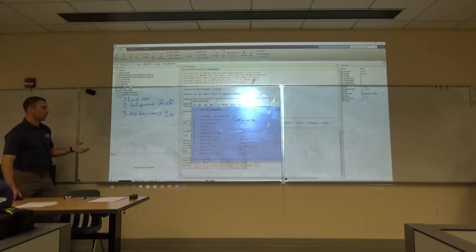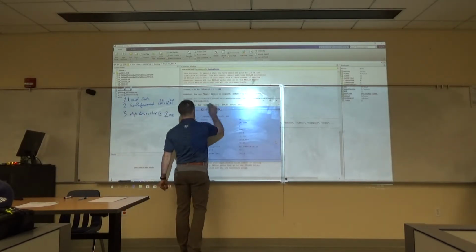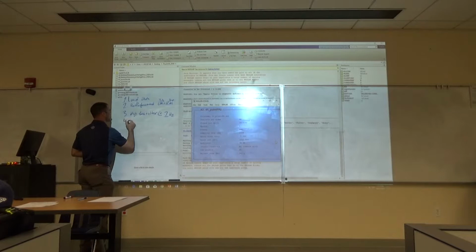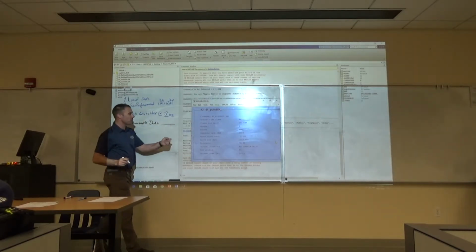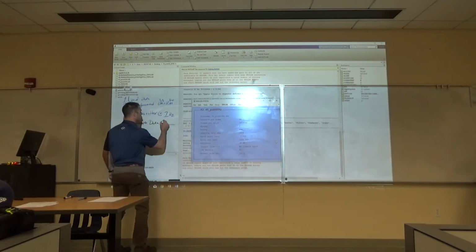So we got to do another step now. Yeah, and we did this last class too, if you remember. Actually, we did it earlier than filtering, but let's do this next. Next, we downsampled, didn't we? And what do we downsample it to? Remember here it says our sampling rate is 1,024? You guys remember what we downsampled it to? We had 256. Yeah.